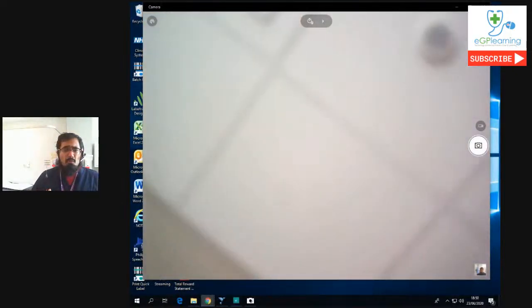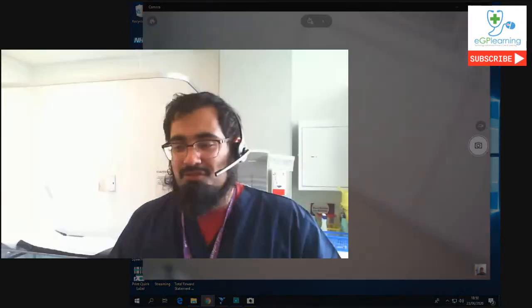And this is a 0.3 megapixel camera, which is really, really minor. I mean, if you compare that to what many phones have, 12 megapixels, 10 megapixels, massive difference that you can see. And you know what? That imagery is actually quite useful.